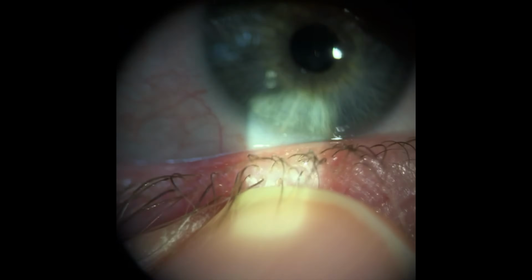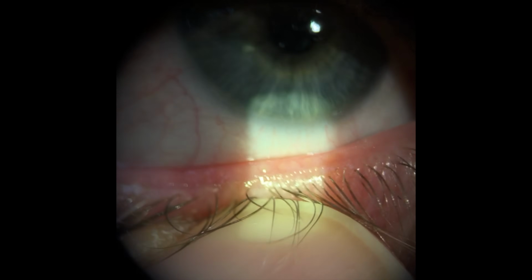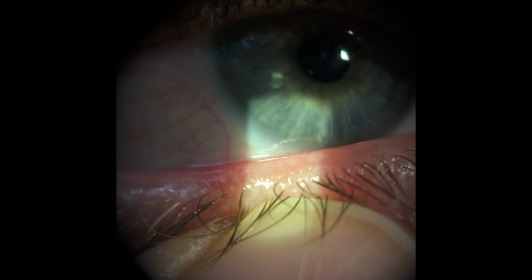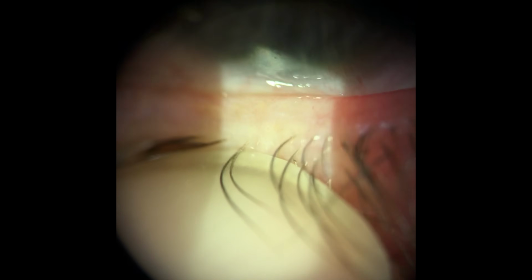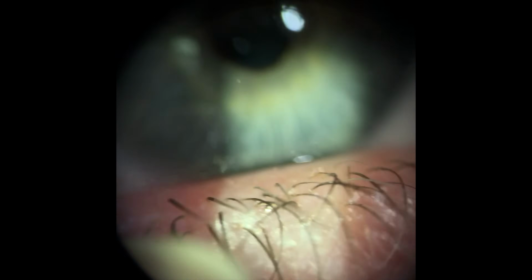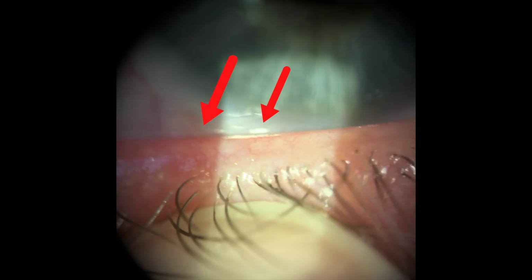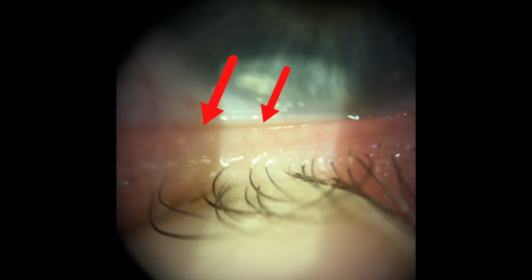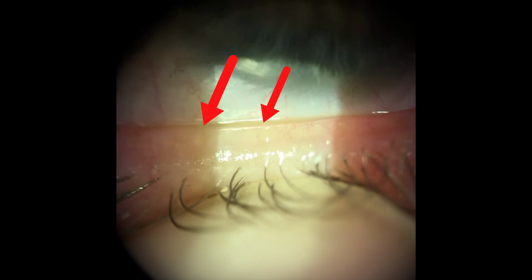First, expect that your doctor is going to push on the margin of your eyelid very gently to try and express some of the oils trapped in those meibomian glands, because they want to see the quality of those oils. First, we want to see that oils are coming out, and ideally the oil will come out like a smooth olive oil or something like that. But unfortunately, for a lot of people, when there's inflammation present, we can see those oils coming out as kind of a milky, cloudy appearance. Or for some people, it's almost like popping a zit or watching wax slowly ooze out of those glands.